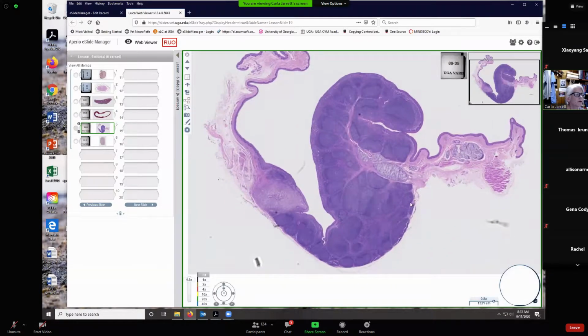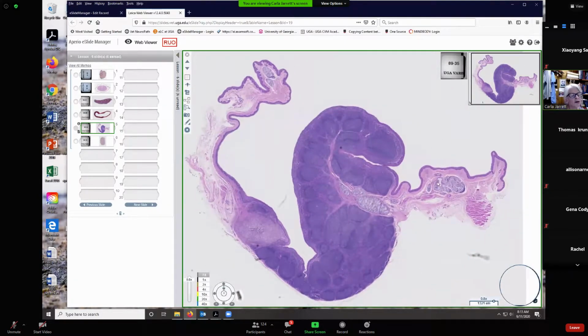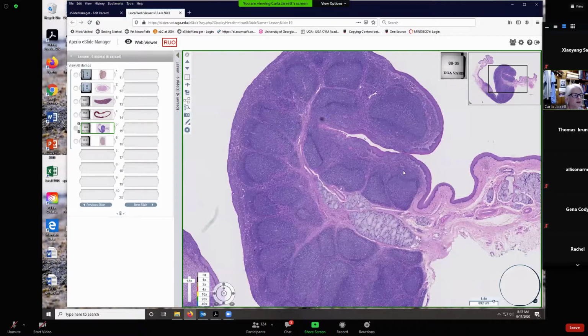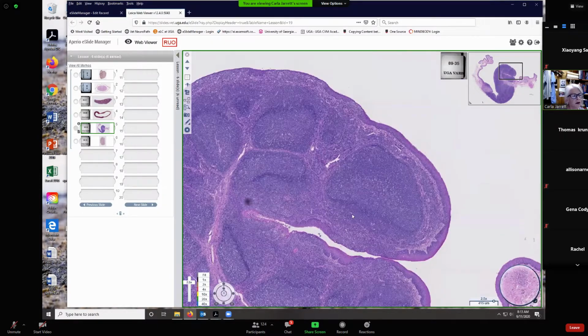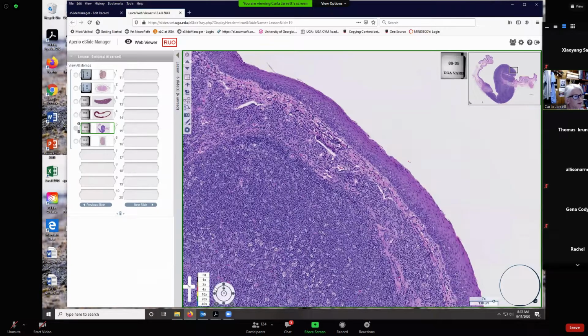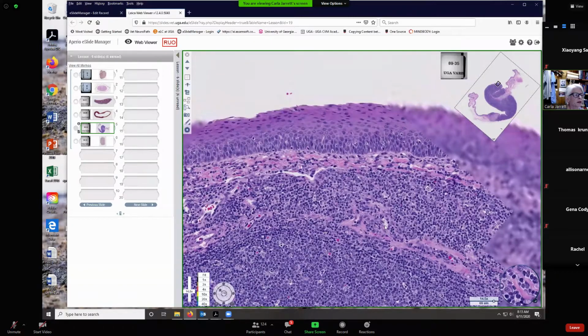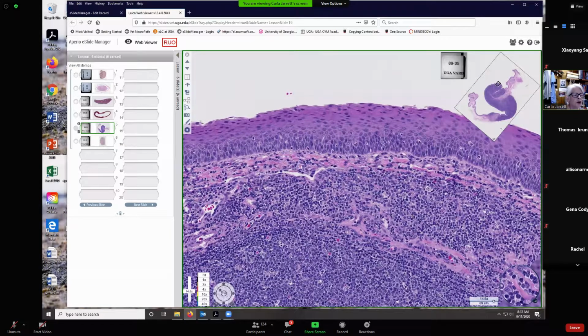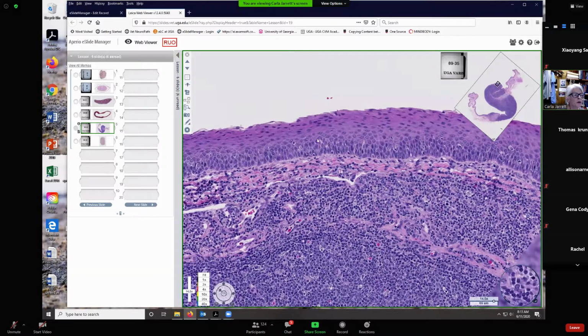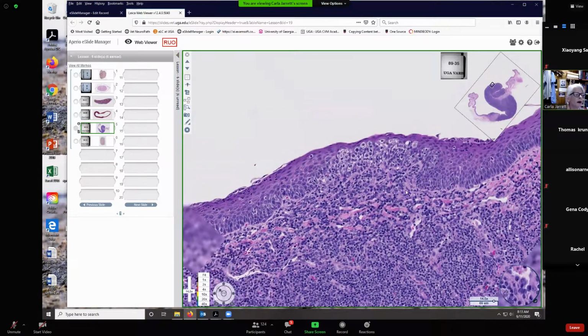The carnivore tonsil has a little bit more additional information to help you know it's a tonsil. The key in recognizing a tonsil is always the stratified squamous epithelium. And don't think, well, that's a weird and unusual stratified squamous epithelium, I'll never recognize it. We'll just drive around. Here's fairly normal looking stratified squamous epithelium right here. Again, it's non-cornified.